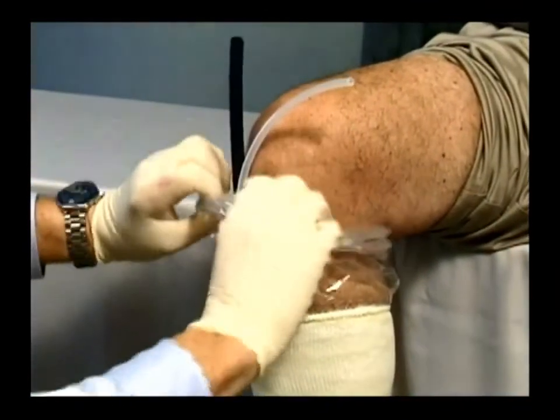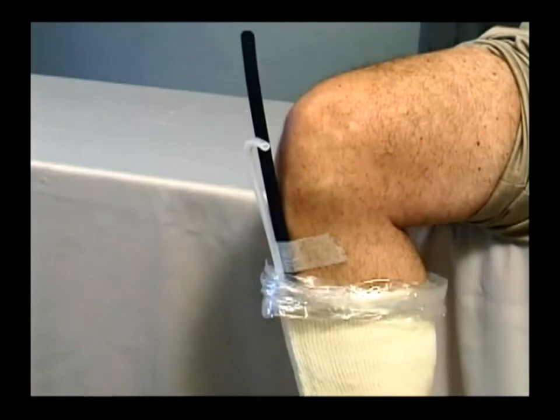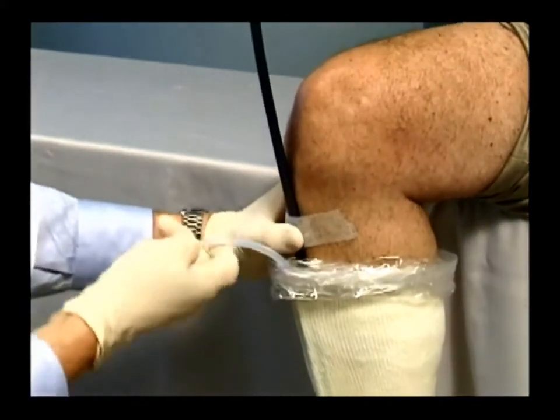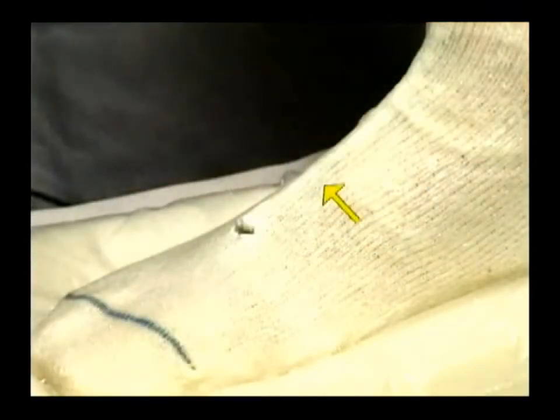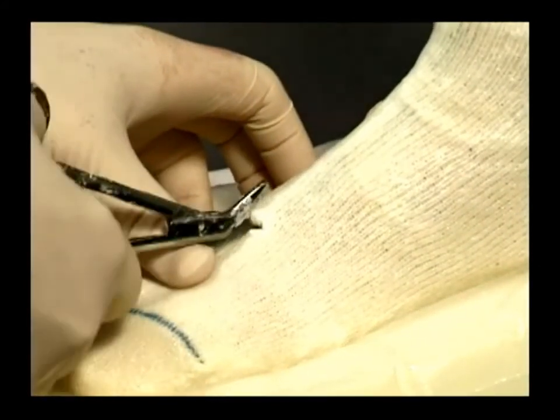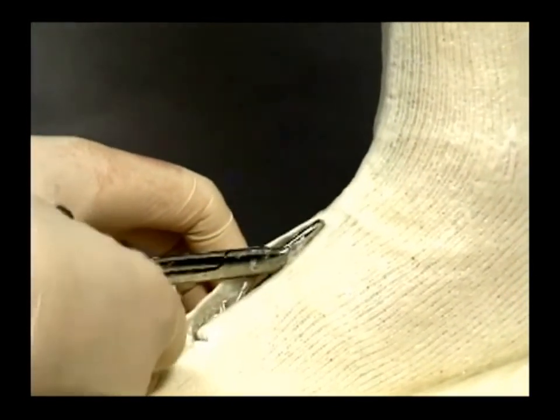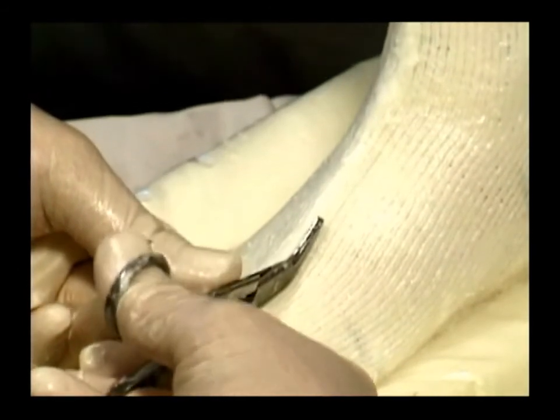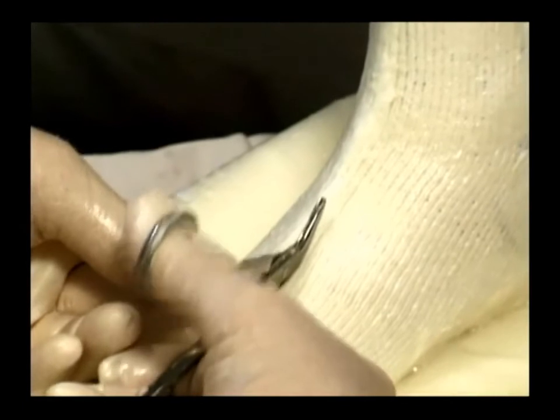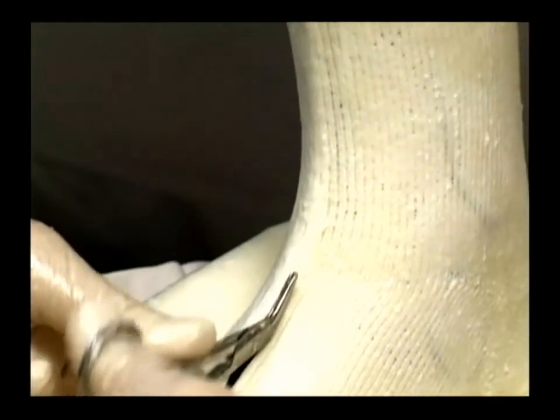When satisfied that the cast resin is fully cured, use care in removing the channel tube. Make sure the underlying cutting strip is held in place during the removal process and not inadvertently pulled out with the tube. Using a gentle, sustained pulling motion in the direction of the patella, the tube will suddenly be released from its hold-down tape strips. Removal of the tube will create a channel which facilitates the removal process. Using the STS or similar small removal scissors, place the lower jaw of the scissors in the small opening previously created at the distal end of the channel tube. Position yourself in front of the patient and working toward the ankle, cut through the sock material, making sure you also cut through the plastic bag. Cut proximally up the full length of the sock, keeping the scissors in the center of the channel. Cut the entire length of the sock exiting at its upper margin. Use a slight upward pressure on the scissors, keeping them away from the underlying strip as you cut the length of the sock along the channel through the proximal margin of the mold.